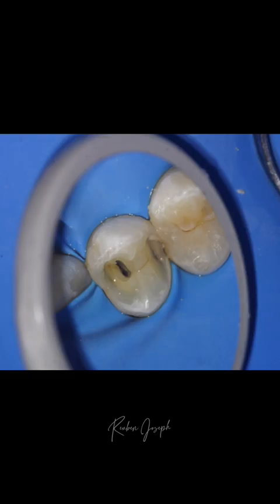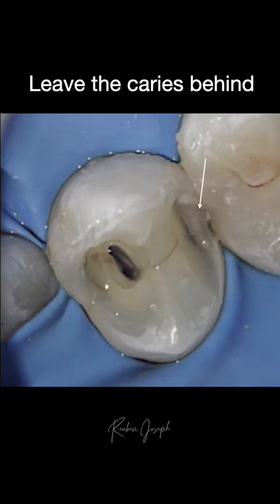To begin with, I want you to take a good look at this picture. I'm sure the first things that come to your mind are the well-designed endodontic access cavity and the good isolation technique. But then there's something that you're entirely missing here. If you zoom in, you will see that I have left behind a lot of caries proximally, despite the fact that the whole endodontic procedure has been completed. The only thing that has to be done at this point is obturation.